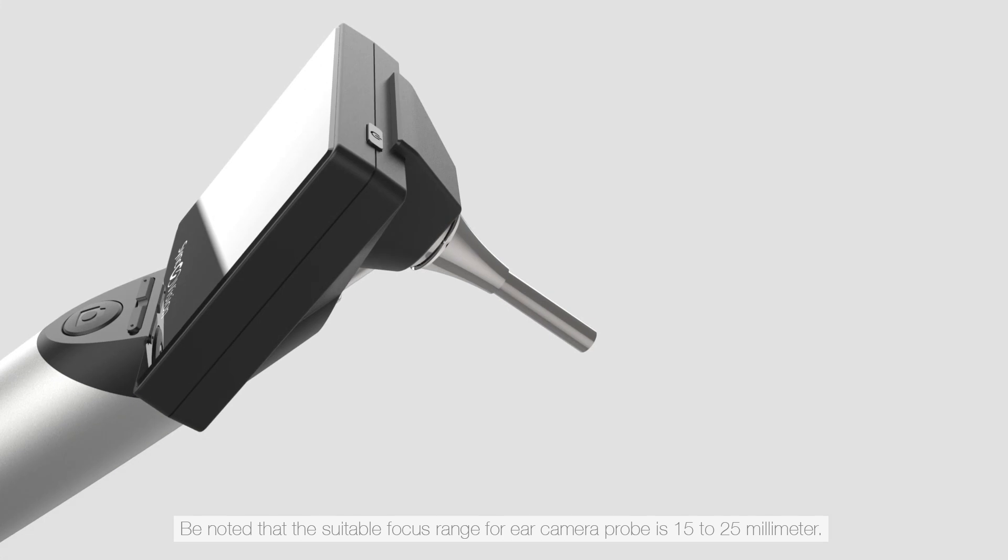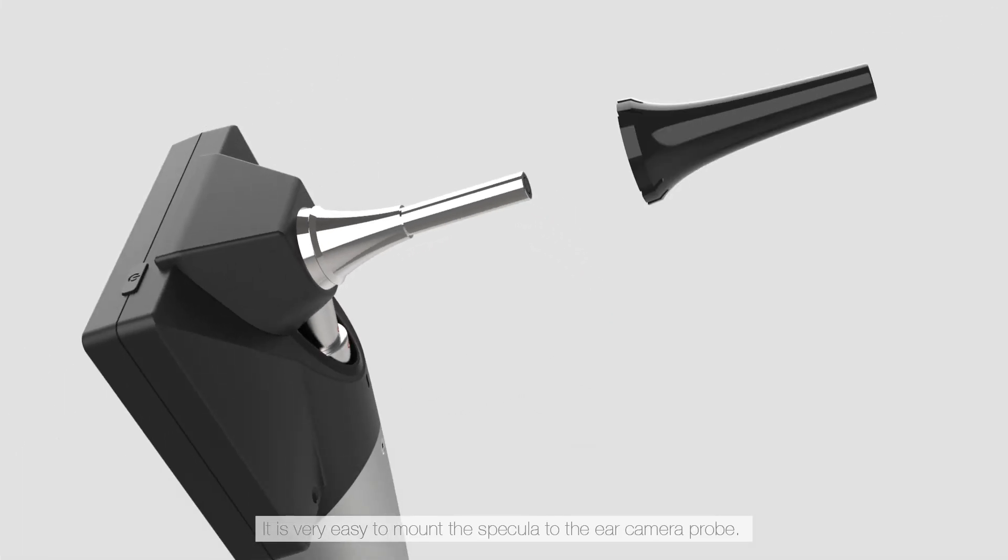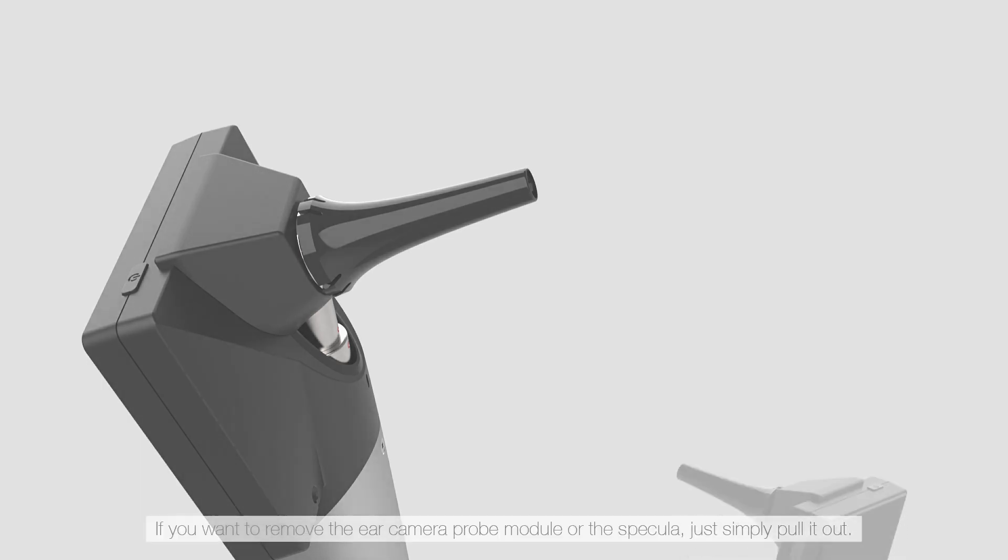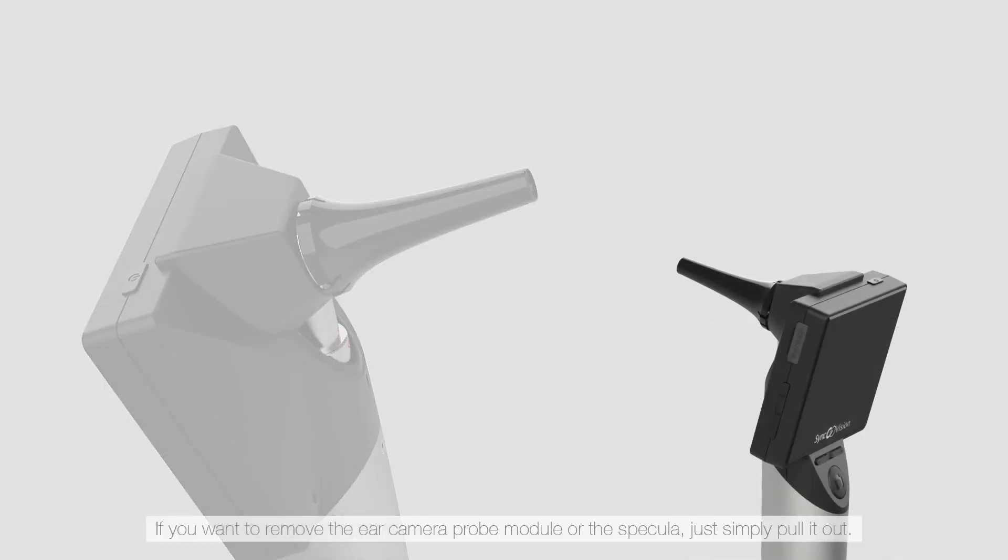Be noted that the suitable focus range for ear camera probe is 15 to 25 mm. It is very easy to mount the specula to the ear camera probe. Simply put the specula on and apply pressure on it. A clicking sound will appear indicating it is fixed in place. If you want to remove the ear camera probe module or the specula, just simply pull it out.